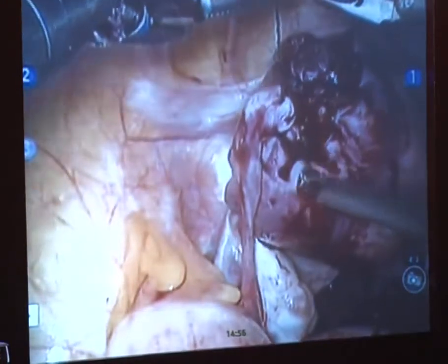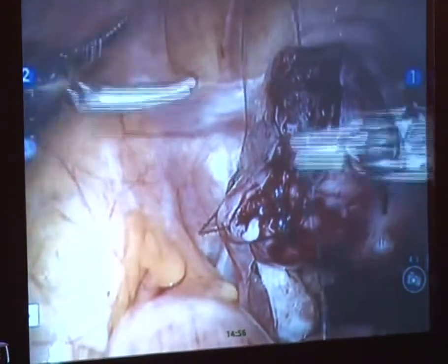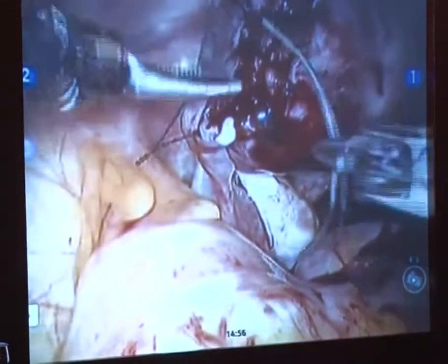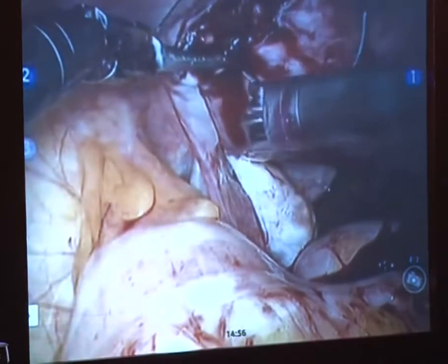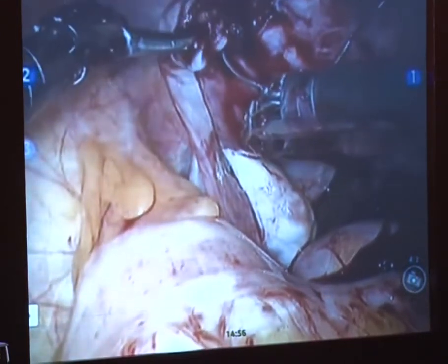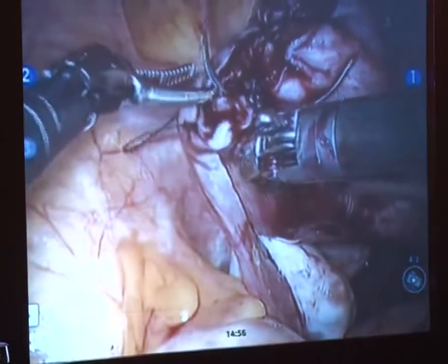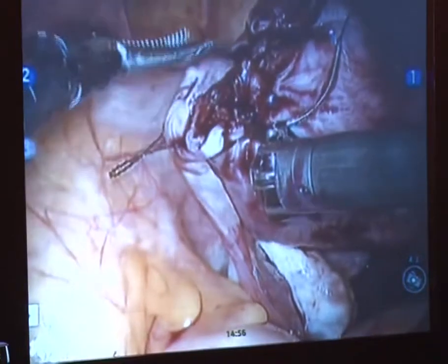I didn't hear the question, guys. Where will our operating ports be when we put our camera port at the epigastrium? Her ports are in the epigastrium. This patient is all in the epigastrium, her ports. There's nothing that's low in her. So our operating ports will be at the same position as with any other normal size, not normal size, this size uteri, right? Myomectomy.